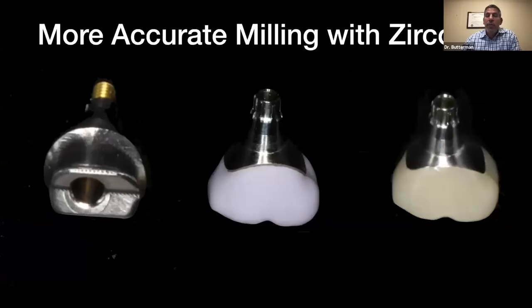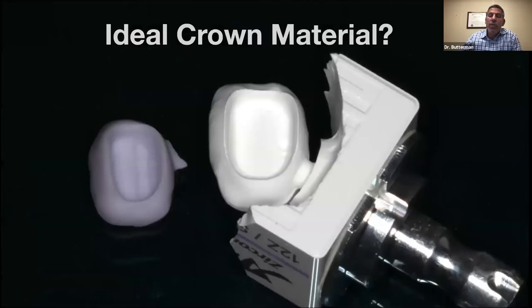Well, here's the issue. Some of these abutments are not ideal for our CEREC milling. And I found that the anatomy is so sharp. Look at the margin with Emax that's milled to it. Because we're using bigger diameter tools and we've got some sharp anatomy on the abutments, the margins just tend to not fit as well. That's why my go-to with any of these Atlantis abutments, whenever I can do it, I want to use Katana for it.